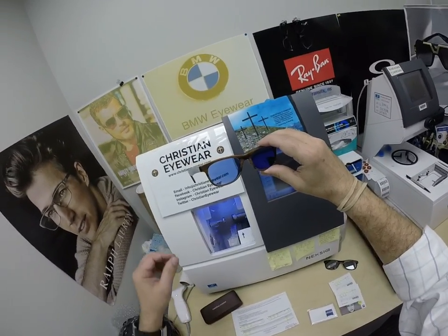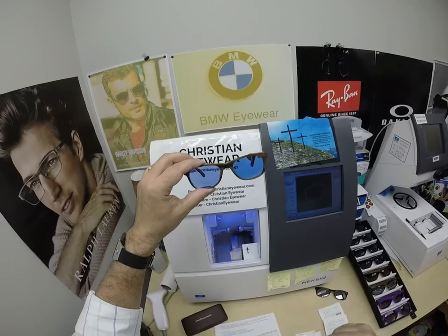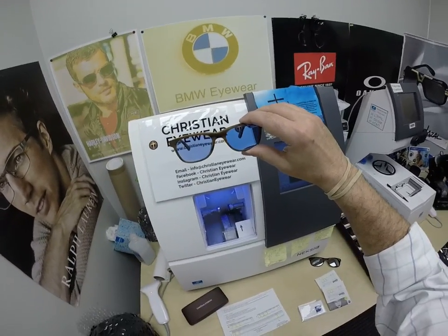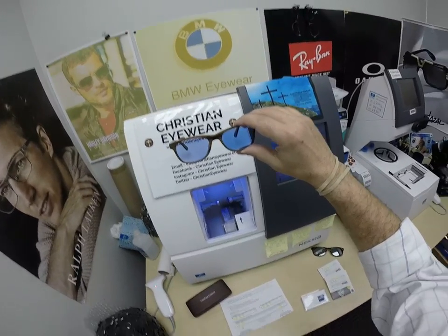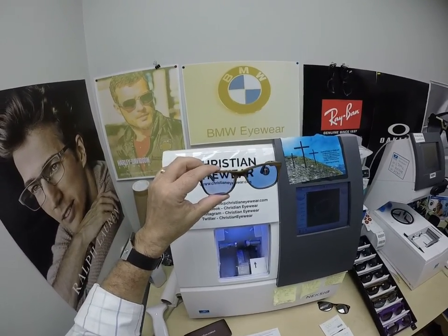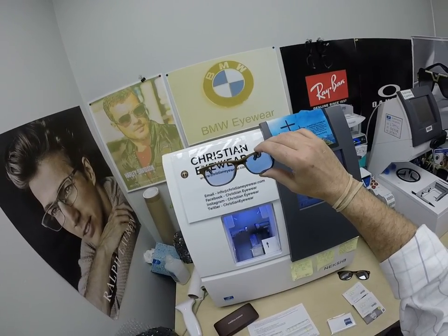These frames sell for $149 complete — frame and single vision lenses. I can do the line style bifocal for $149 complete as well. Tammy and I both wear the progressive lens, which is a premium Zeiss lens, for $249 complete. If you go to a doctor's office and order progressive lenses in plastic, they're probably going to charge you $249 or more. These are thinner, lighter weight polycarbonate — they're virtually unbreakable, impact resistant, with 100% UVA and UVB protection built into the lens.